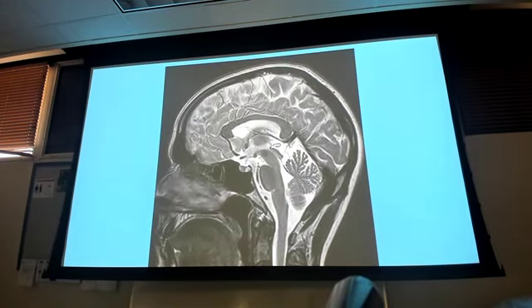It's just a really cool picture. Right? You don't have to read this, but you can see the different parts of the brain, right? The cerebrum, the cerebellum. You can see all that. You see the spinal cord coming down, the CSF. I just think MRI is a really interesting, unique modality, right?